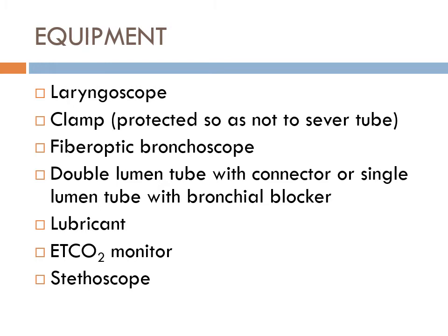So here's the Easy Blocker. Just get familiar with your equipment. So I intubate, I take that out, I ventilate and make sure I'm oxygenating, all that stuff. And then when it comes time to isolate the lung, I think I have to break this off. I don't know why I didn't break it off before. This is trash.